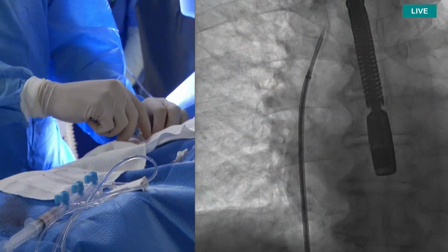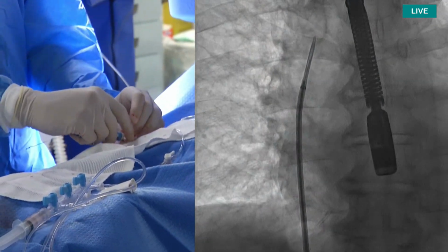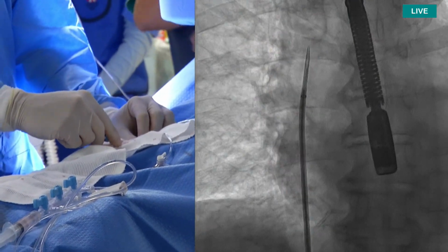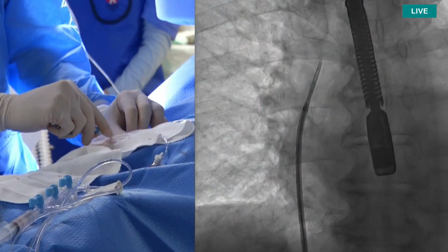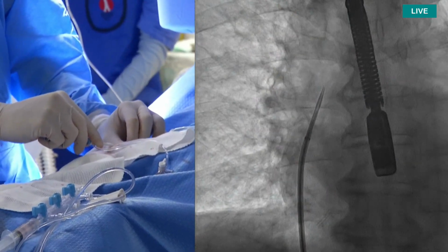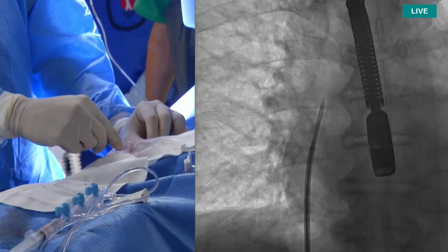So we're going to start to go down around 3 o'clock, I would say. I have my right hand on my needle. My left hand is going to help to put the Swartz down, and I have one finger in between those two. So you can already go to 4, 5 o'clock, I would say, because we aim for a little bit posterior puncture.